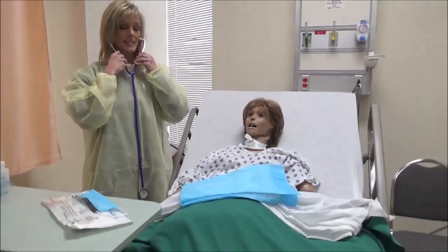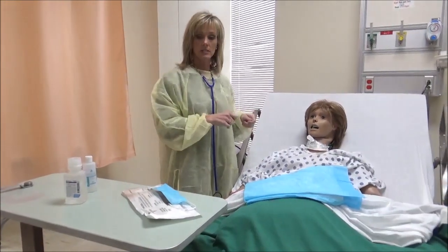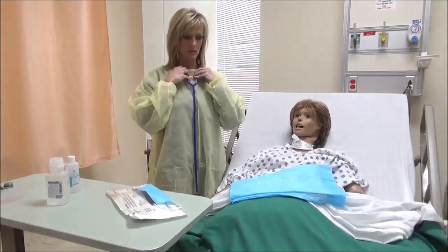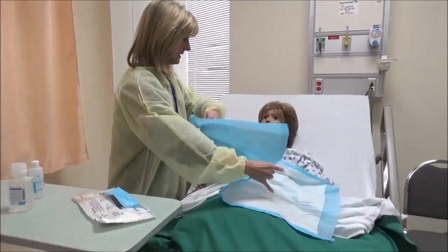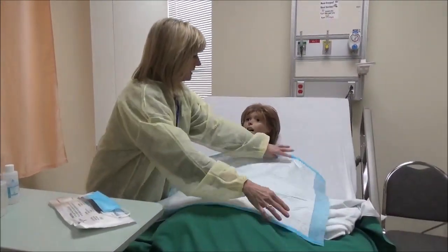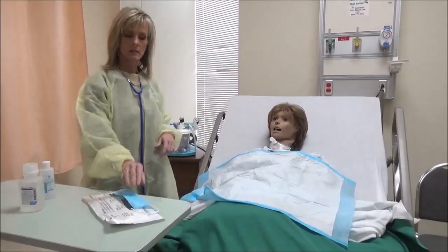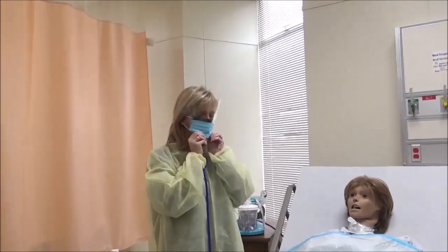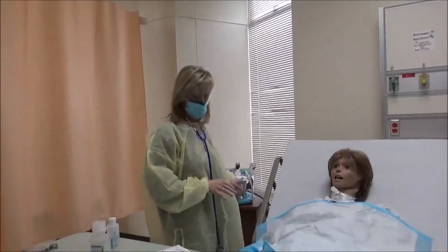So at that point I'm going to do this. I need to leave my stethoscope here around my neck so that after I suction, if the first time I'm unsuccessful in getting all the secretions out and they need suctioning again, I've got my stethoscope here and readily available. So I'll go ahead and place the drape over my client. Make sure that I check my O2 probe. Let me go ahead and put my mask on. Got that in place.